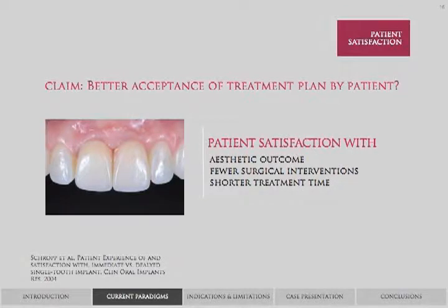This slide is very important because today, with media, patients are coming in asking you for these procedures. They're going to say, doctor, I want immediate implant placement, not knowing much about the science behind it. You ask them why, and they say, well, I want more comfort, improved aesthetics because I've been told immediate placement improves aesthetics, better chewing, better phonetics. These are the patient parameters.